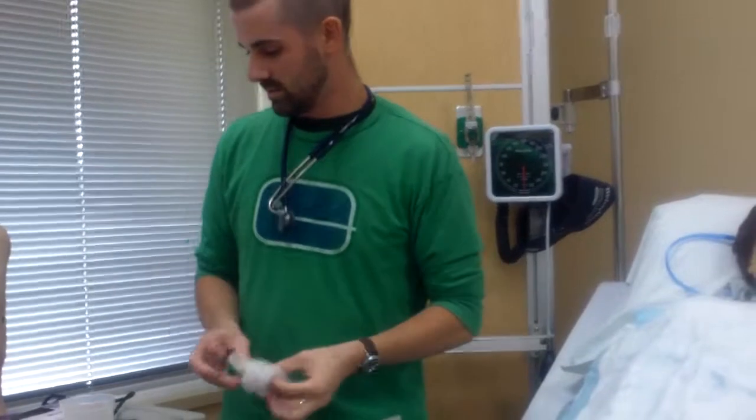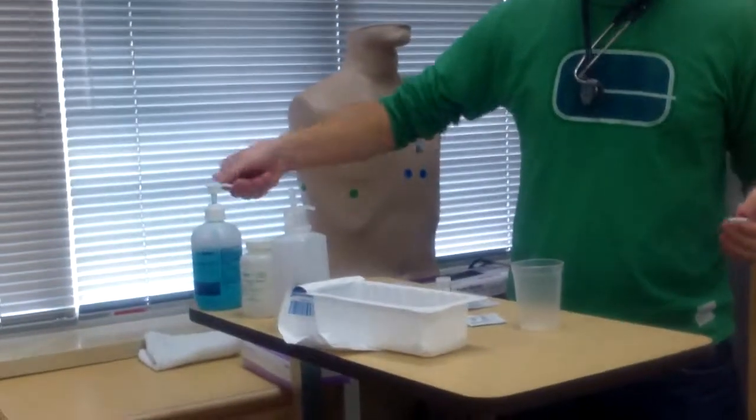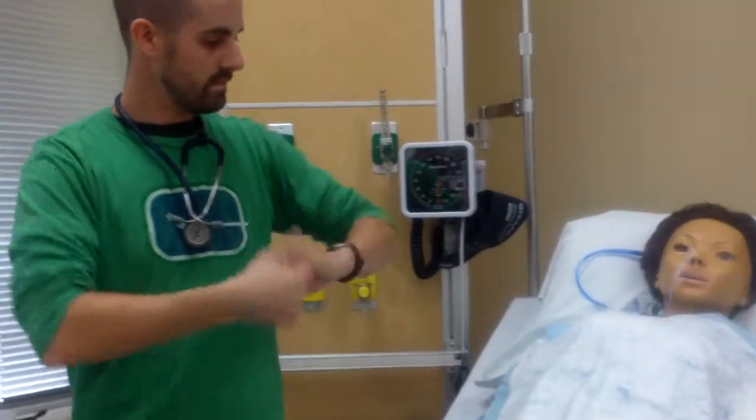So I'm going to take my gloves off here, get some new stuff. Garbage, hand hygiene in between. Okay, now I'm going to explain about the removal of the tube. That this is going to be a little bit of an uncomfortable process, but they're going to feel a lot better once I do it. There might be some irritation to the back of the mouth and throat area and also to the nares once this happens.